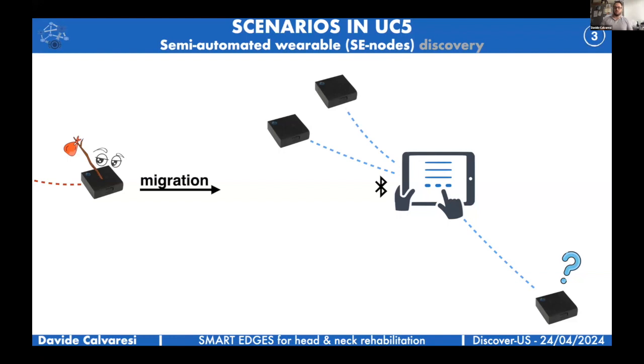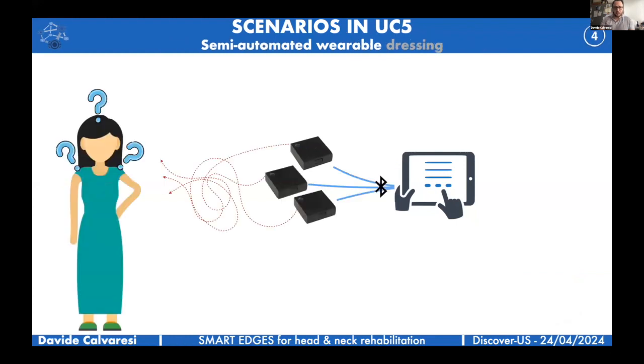The step zero of all of this is clearly to allow the technology to blend together, so to allow semi-automated device discovery, so that components from the same network or from other parts of the system can join and live seamlessly. This is not our first project that involves wearables.